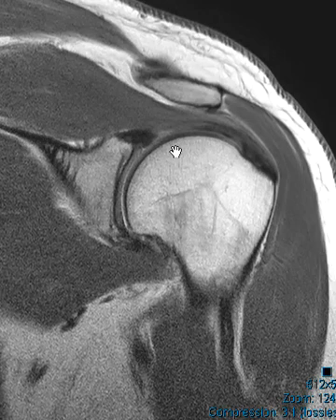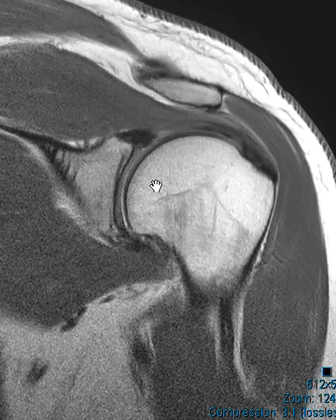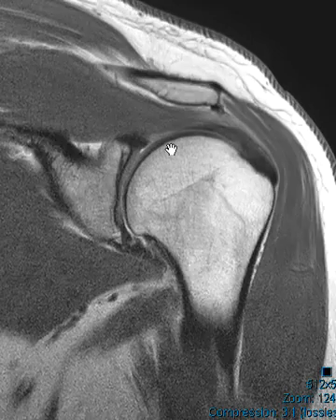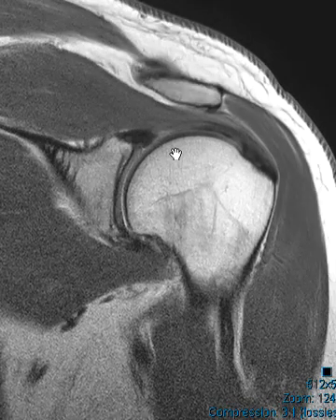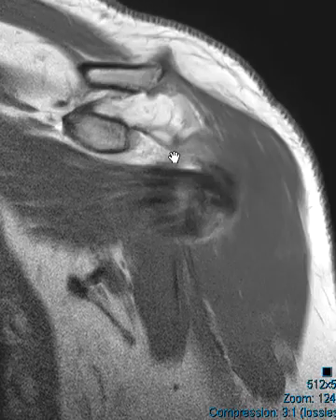Instead of using that spinal needle, which is pretty big, you just use the 25-gauge numbing needle. If they're small, just keep going in with that same numbing needle — they have very little symptoms. We have longer needles too, in case they're a little bigger, then we use a 25-gauge longer needle. If you go absolutely straight in right here, it works nearly 100% of the time. Before that, I used to go down low and angle, and there was a significant number of times where it didn't go in, which was always very frustrating. And then once I tried this, it started working. A lot of our colleagues now do it this way, and I think it's a very good approach if you don't already do it like this.